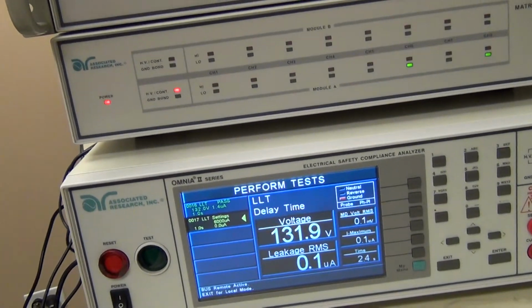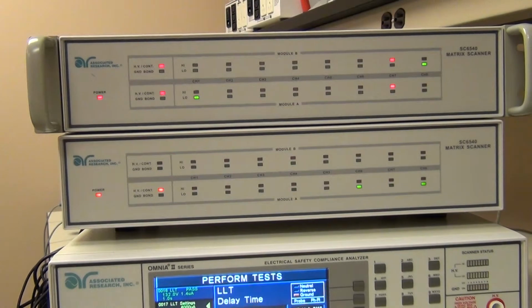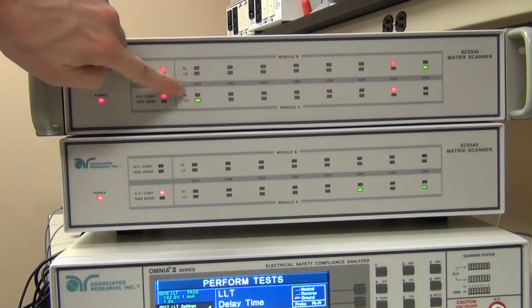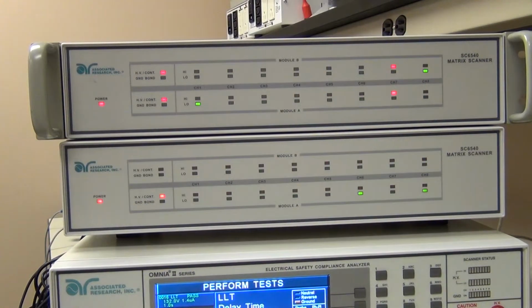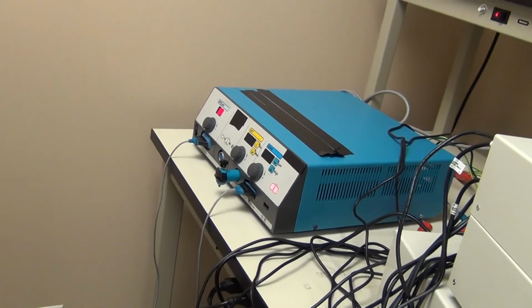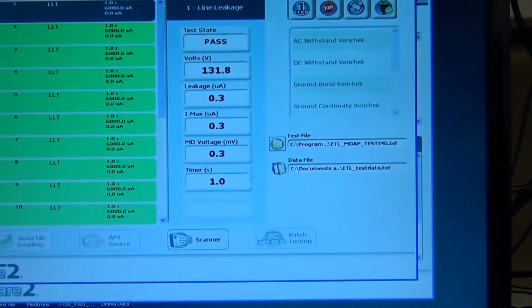And then finally, on our last mains on applied part test, I flipped the polarity of this circuit. Now we have neutral connected to probe high, probe low connected to patient lead 1, while line voltage and PE are shorted together on the medical device. You can actually see it powered up here, doing its thing. And the test sequence has completed.